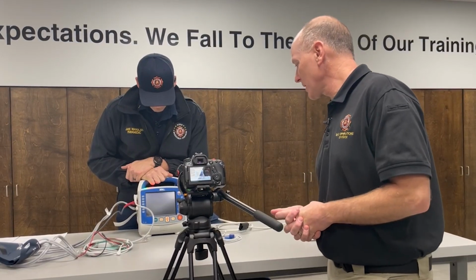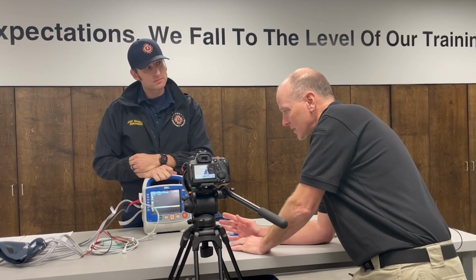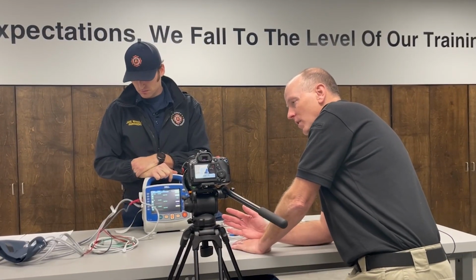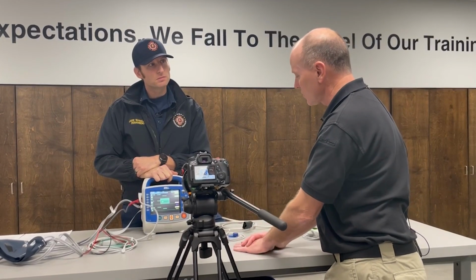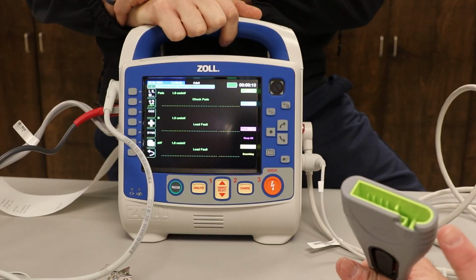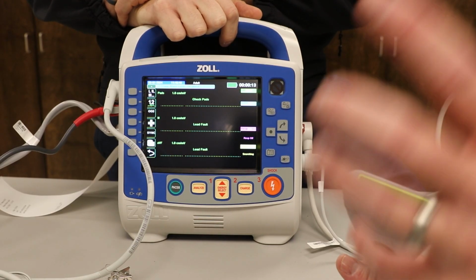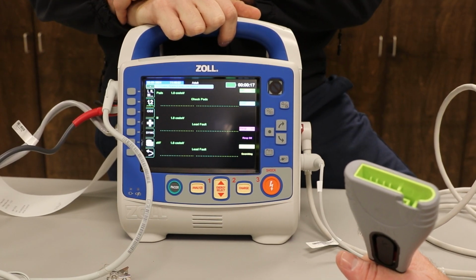So once we turn the green button on, this is your guys' AED. Now remember, we're trying our best to do every one of our initial pad placements anterior and posterior. All right, so if we do our pads anterior, posterior, the pads are actually going to come through here. So if your pediatric pad is anterior, posterior, this should automatically decrease that joules, correct?